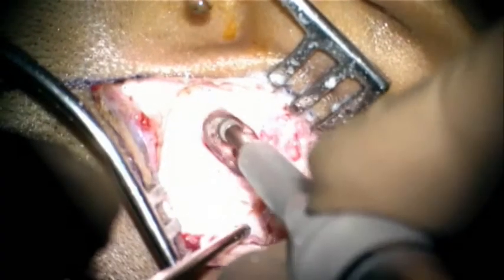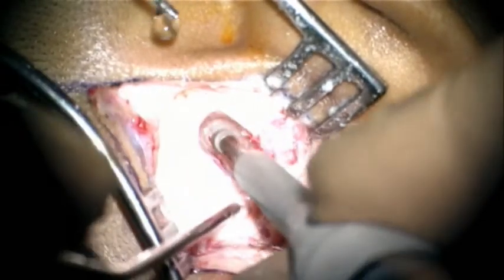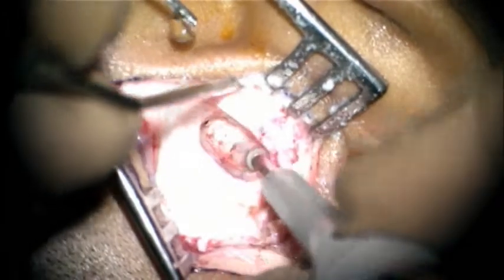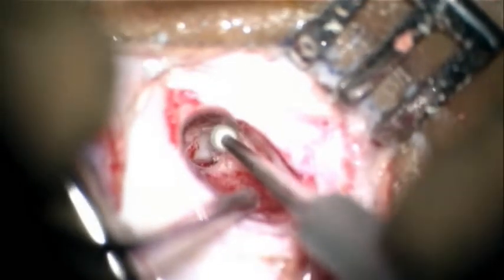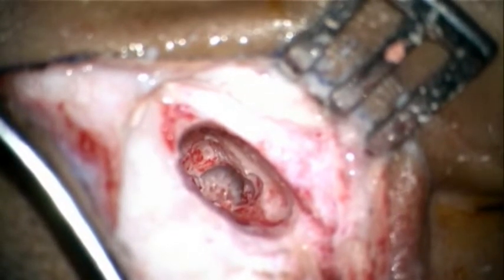A post-aural incision is taken and a cortical mastoidectomy is started. At the floor can be seen a Koerner's septum, which prevents us from looking into the antrum. The Koerner's septum is now opened and the antrum can be seen below. The Koerner's septum is opened completely and the entire antrum can be visualized.